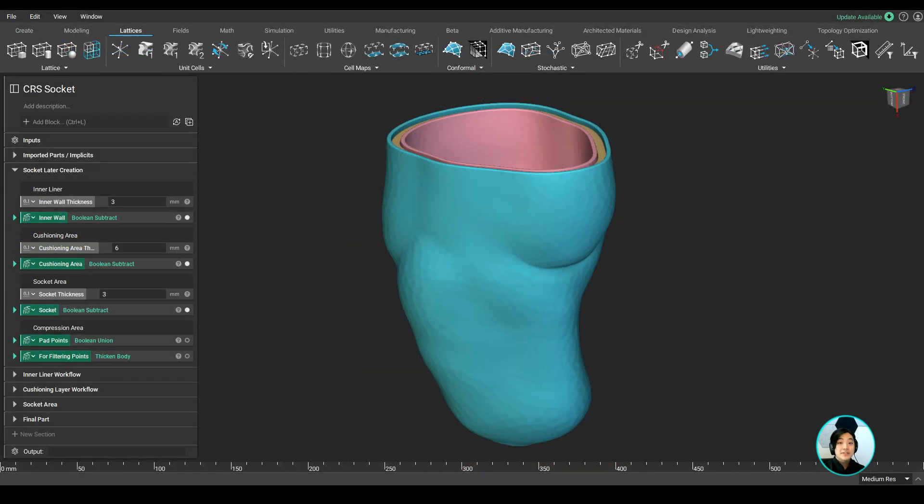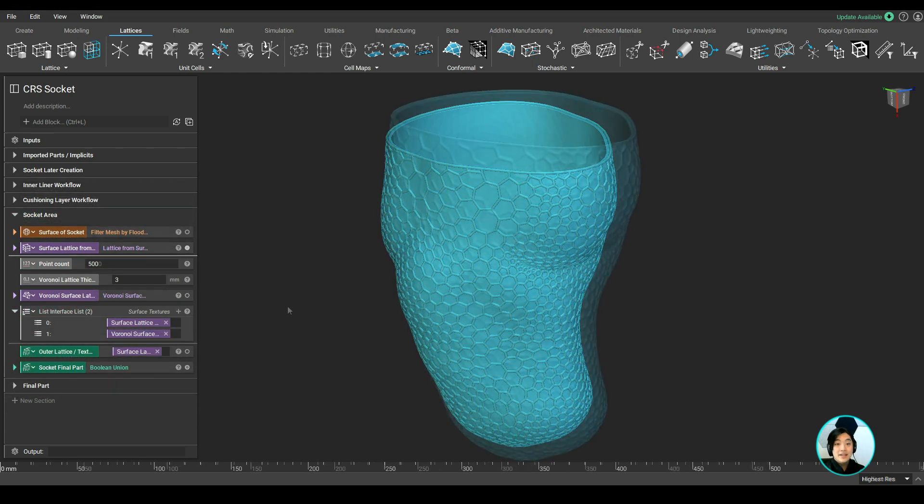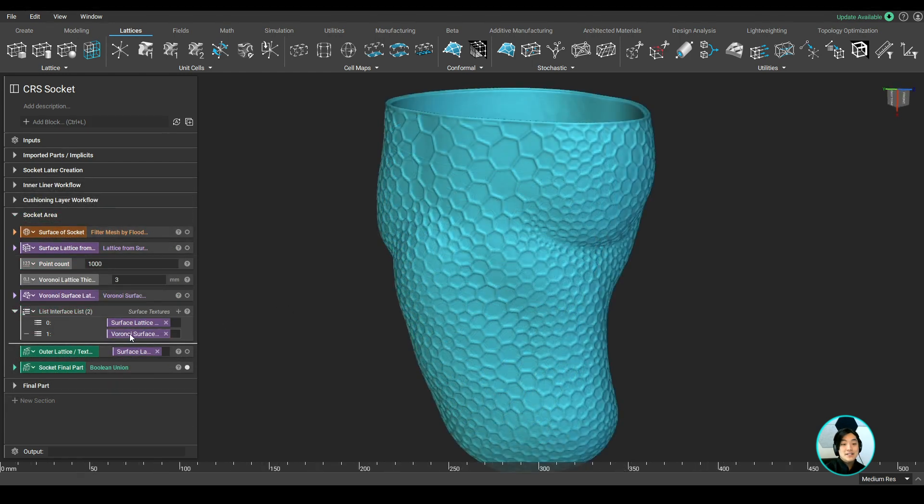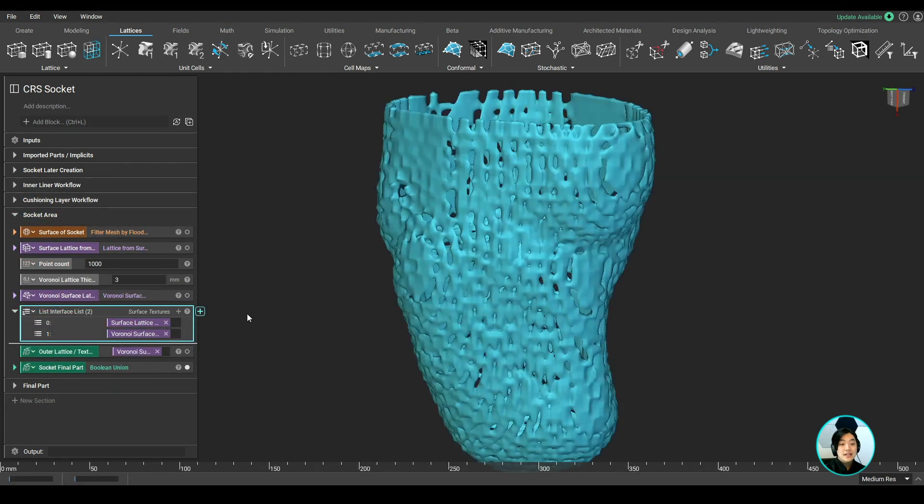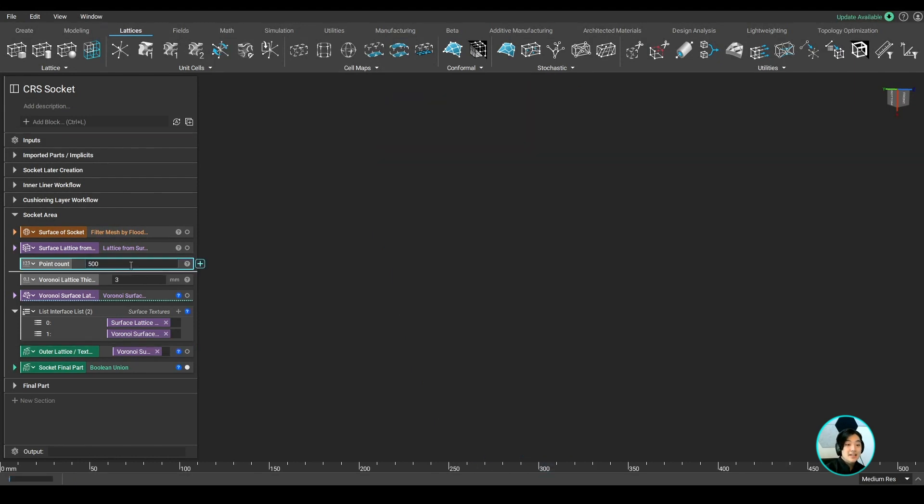On the same topic of lattices, we can also generate lattices on the surface of any bodies in nTop. Adding lattices or textures can help the socket improve its structural stability.